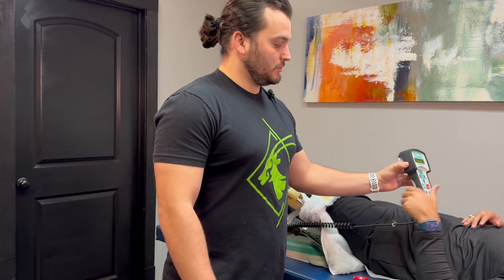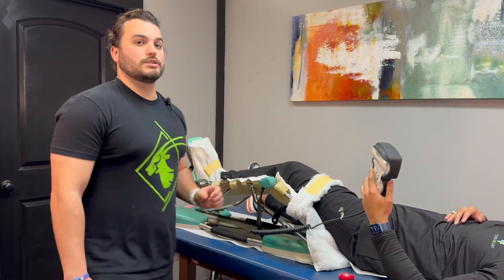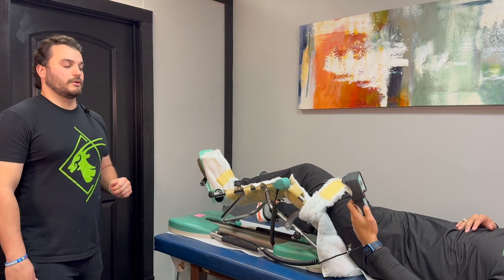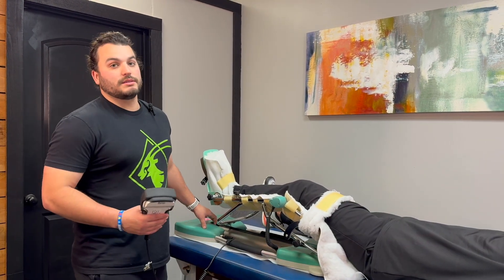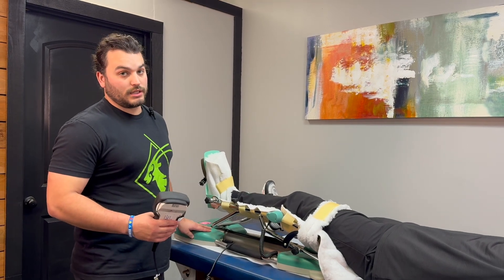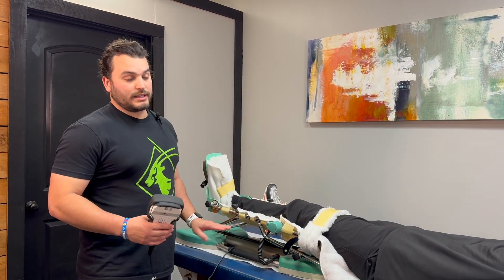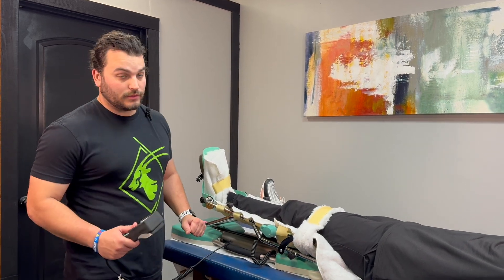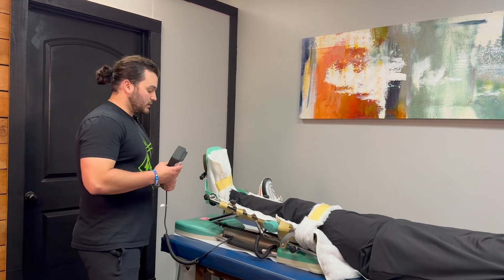The patient will have the controller, so they can do whatever they want — slowing it down, speeding it up, working on the degrees. The average time you want to be in the CPM machine is about 6 hours. You do not want to sleep with this machine going while your leg is in it, because it can be a very hazardous thing and you will end up injuring yourself.